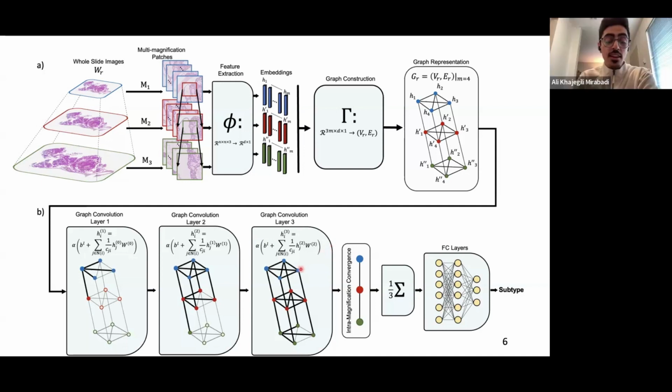Yes, the idea here is broadcasting and reaching all the nodes. If there is any important information in any node, it should reach all the nodes. So if the important information is here, it will pass to all the nodes. And if the model is doing good, it will get that information. If your features are good, it's going to pass to all the nodes.